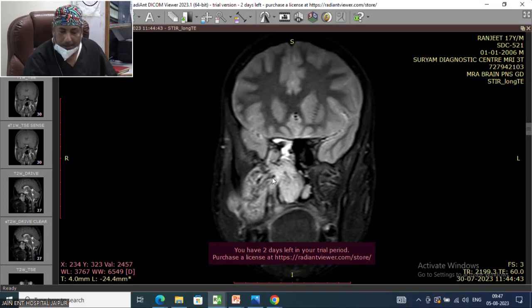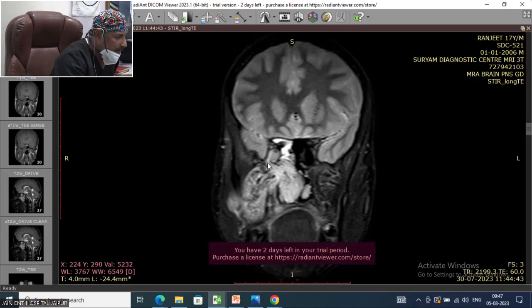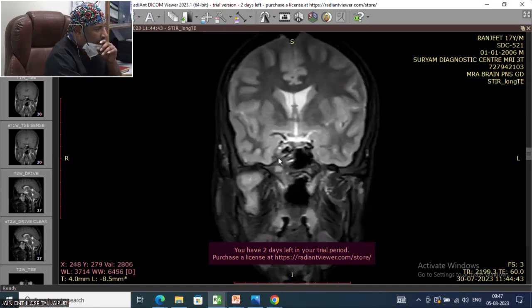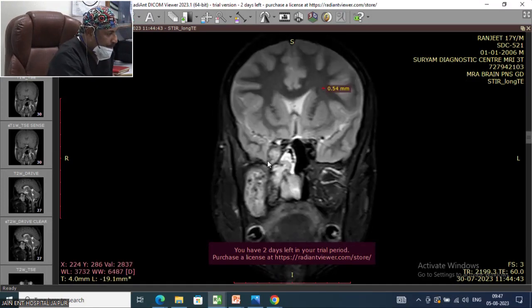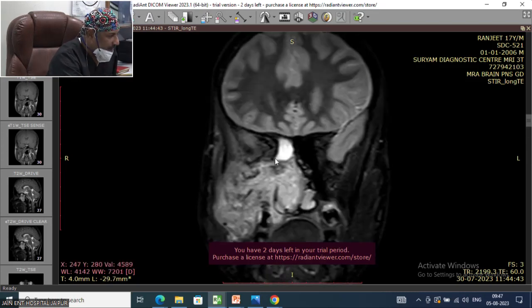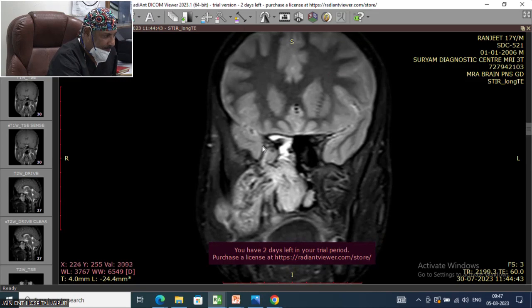But the primary tumors generally do not invade; they grow by compression, not by invasion. See, the interface with the surrounding is very clear. Can you see this tumor going into the orbital fissure, but all around the periosteal plane is intact? That gives useful information that it is not invasive.